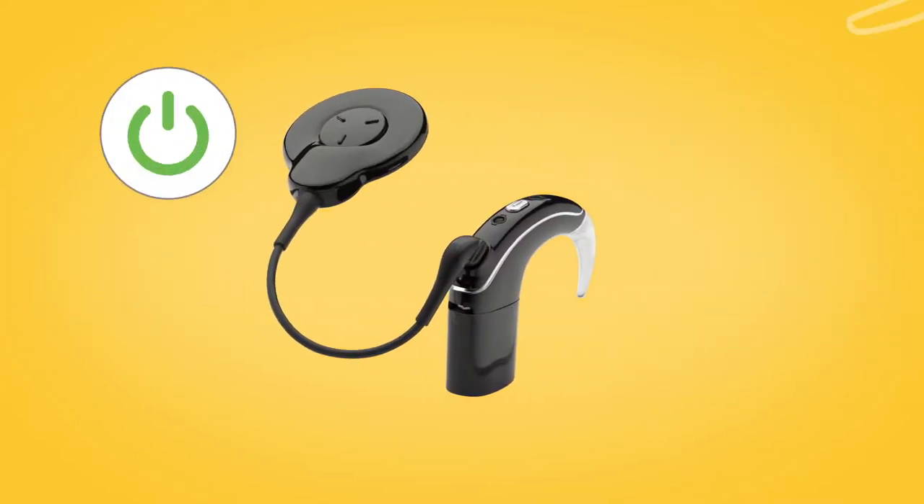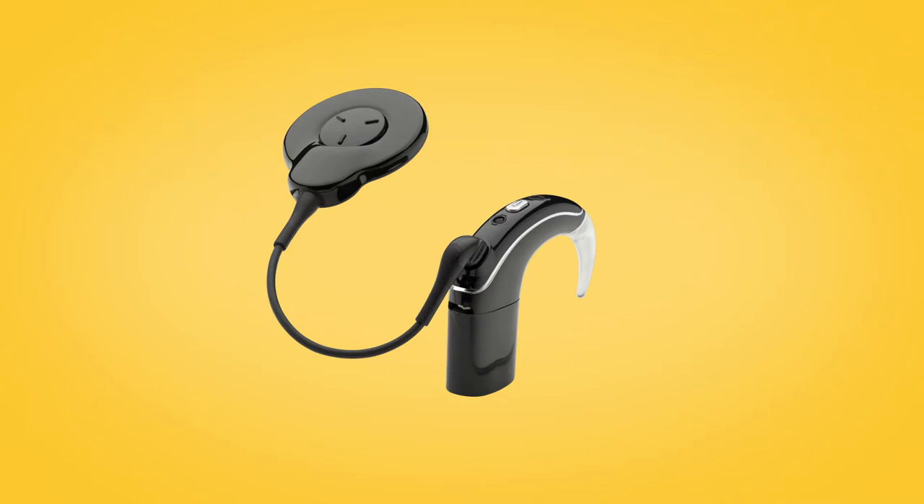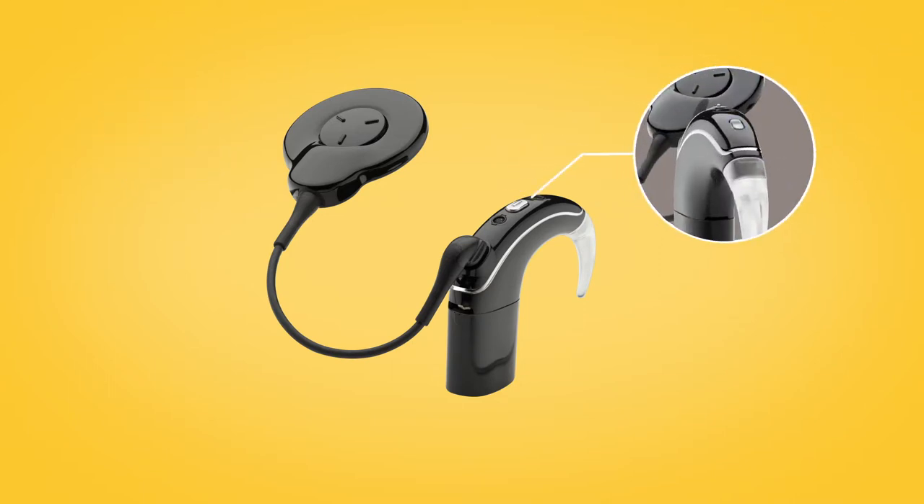During these 20 seconds, switch on your sound processor. Your sound processor will briefly flash a blue indicator light to tell you pairing has been successful.